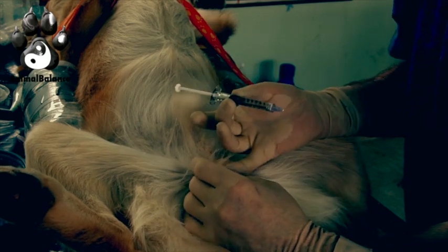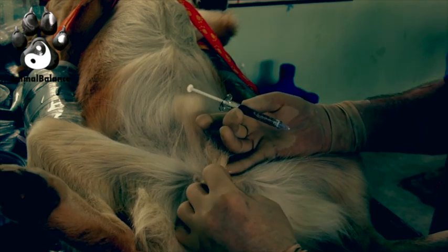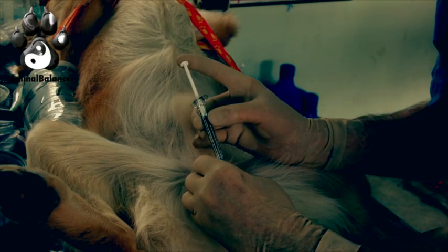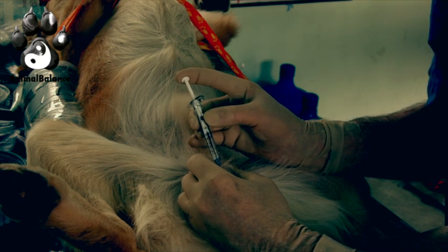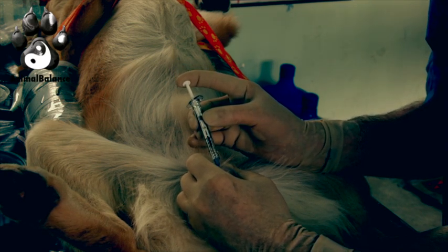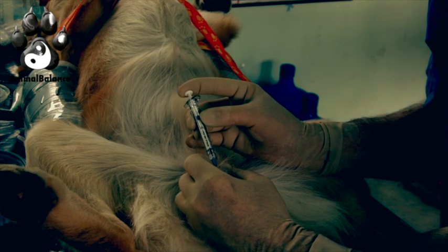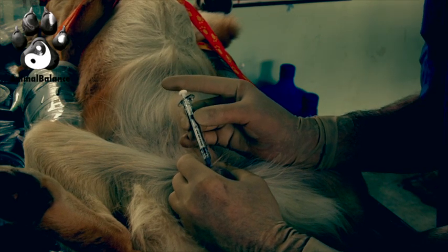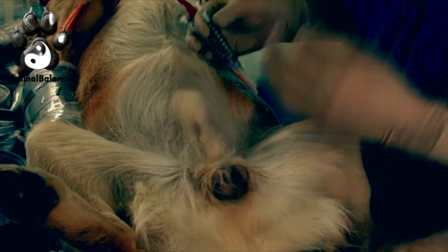For the left testicle I bring it up into the scrotum — I don't want to push it pre-scrotally. I palpate for the head of the epididymis, identify that landmark, and inject into the center of the testicle. I can use my left finger to stabilize the hub so there's no motion — it's critical to have no motion within the testicle with the needle in place. Again holding for three seconds, finger off the plunger, then simultaneously withdraw and release pressure off the testicle. This dog has now been zinc neutered — non-surgically sterilized.